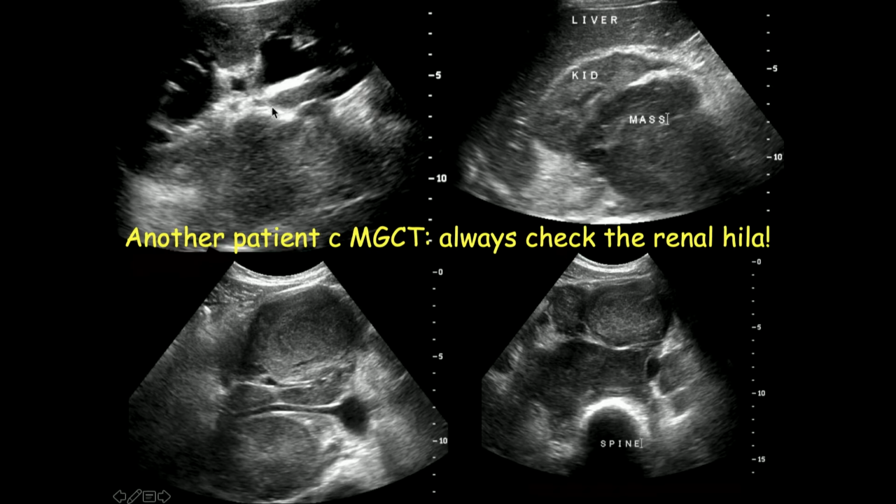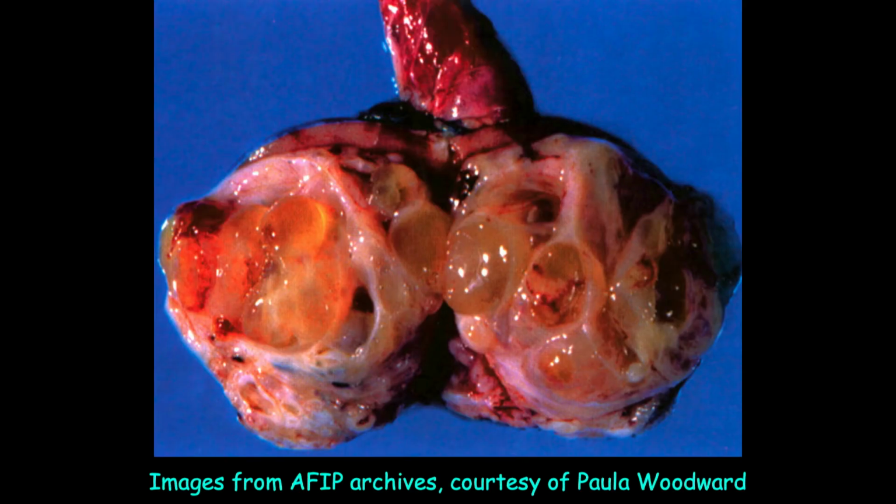We go ahead and look, and we live in America, we're blessed, so everybody's getting a CT scan, but we like to get a jump on it. So if we diagnose a testicular tumor, we take a quick look, we don't charge for it. And massive mass causing hydronephrosis. Here's the mass up here. Look at the poor renal artery just completely bracketed by masses there. Here's the spine, the aorta, lots of masses. So adenopathy with testicular tumors is upper abdomen, not down in the pelvis. And this is a classic mixed germ cell tumor.